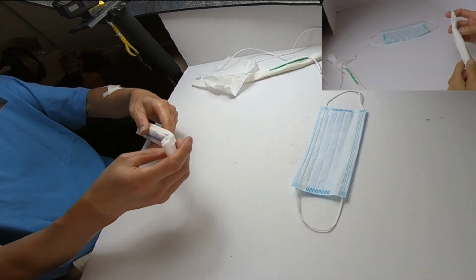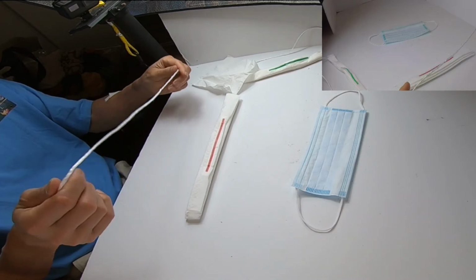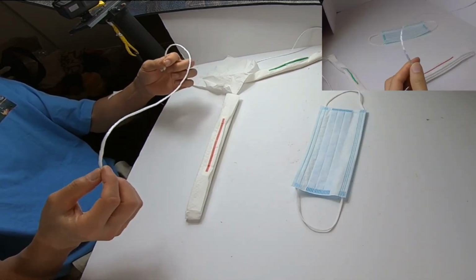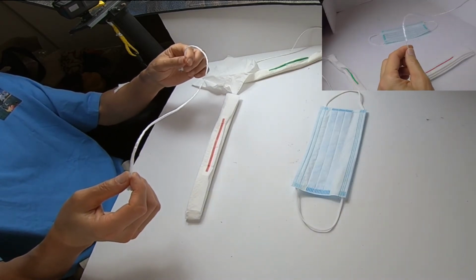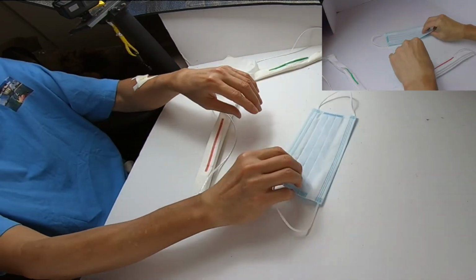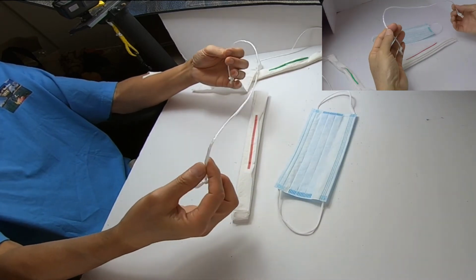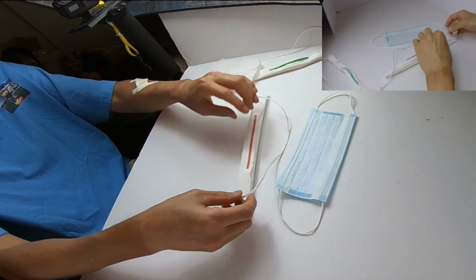So this is actually the mask almost completed. Now, as you remember, earlier in the video I spoke about the length of this string. It goes around your head and just in front of your ear. So this measurement is critical to make your custom mask. The reason why they use elastics in masks is because one size fits all. But if you have the measurement down, then you don't really need to have an elastic. And this tends to be more comfortable than an elastic anyway.